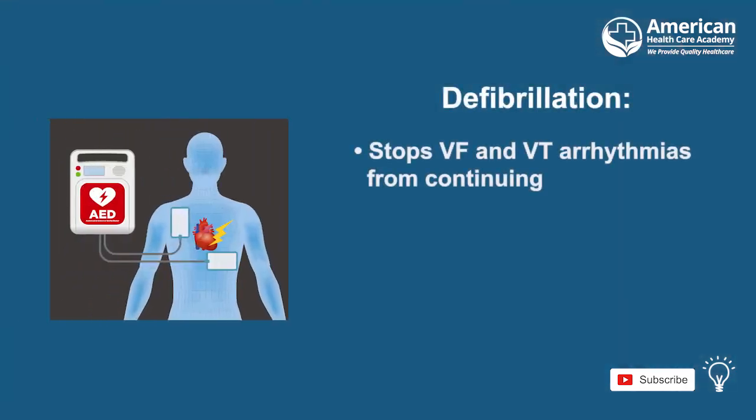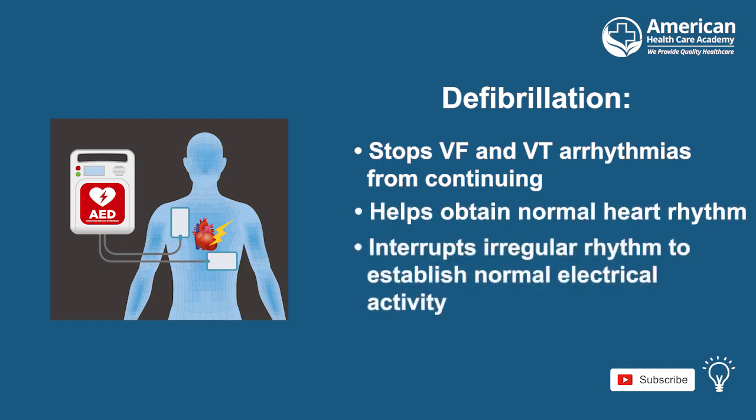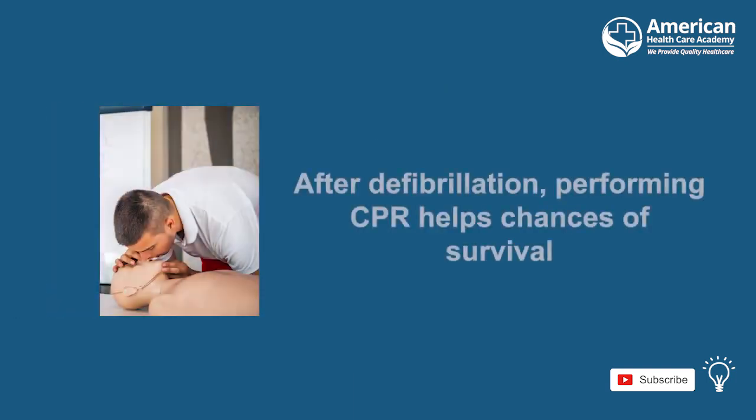Defibrillation stops the VF or VT arrhythmias from continuing and assists in obtaining normal heart rhythm. Remember, defibrillation does not restart the heart, but rather it shocks the heart with electrical impulses to interrupt the irregular rhythm in order to establish normal electrical activity. For the highest chance of survival, defibrillation should be immediately followed by CPR.